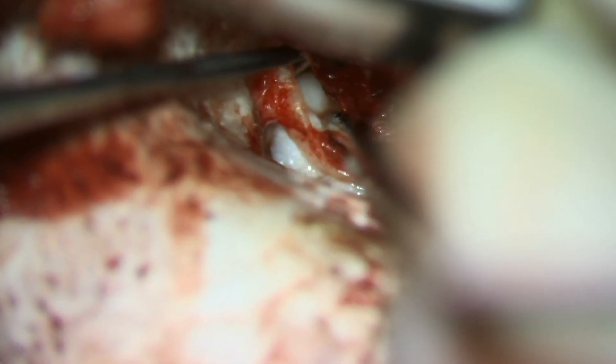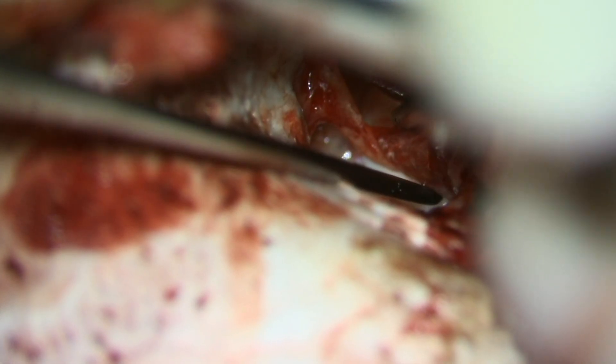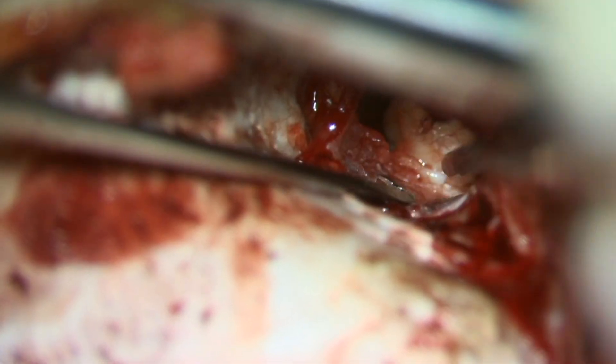Now we can scrape along the bone deep to the cholesteatoma to ensure there's no remaining attachments of the skin to the middle ear mucosa, and we can roll the cholesteatoma cyst inferiorly and then anteriorly to pull it right out.